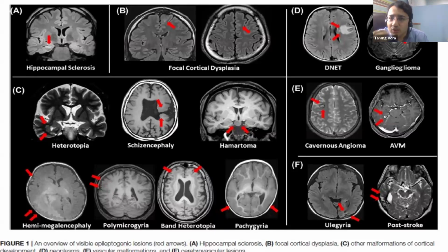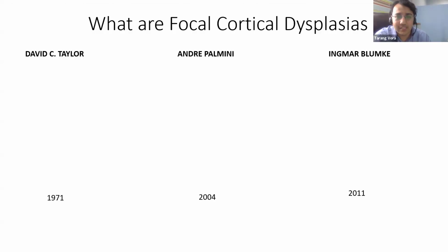But things that are not visible on the MRI, that is what we are dealing with. And when things are not visible on the MRI, but the epileptologist is sure that the seizure onset is focal in nature, the semiology of the seizure is focal in nature, and the epileptologist is sharing data that it does not look genetic or metabolic, then we are looking at the MRI, and the MRI is normal, and then our role starts with the post processing to find out where exactly this dysplasia is.